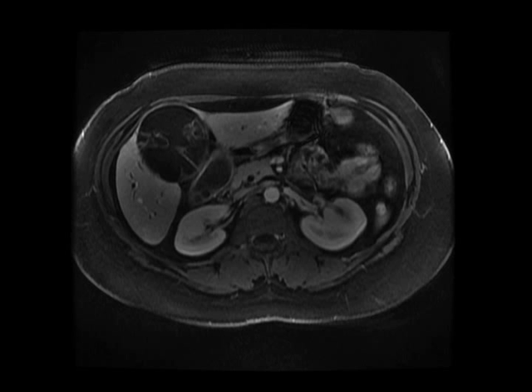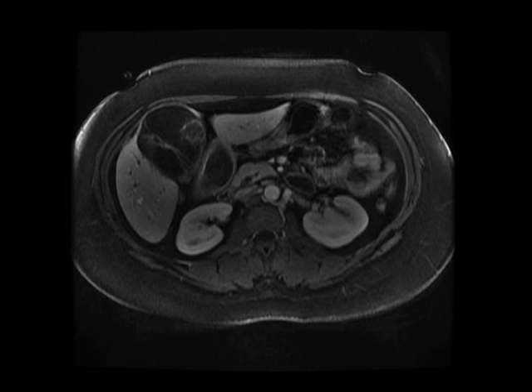In this case, you can see that there's a large cystic mass identified in the right lobe of the liver. It's T2 bright, but notice how it's not homogeneously T2 bright — it doesn't just look like a simple cyst. There are multiple septations, some of which are relatively thick, and there's a lot of internal complexity.